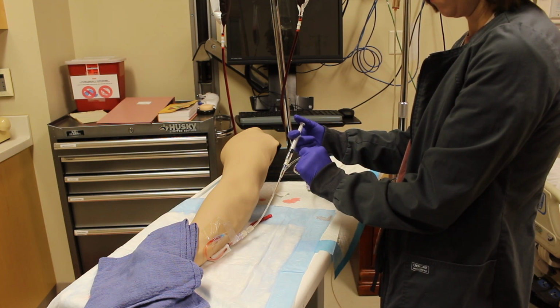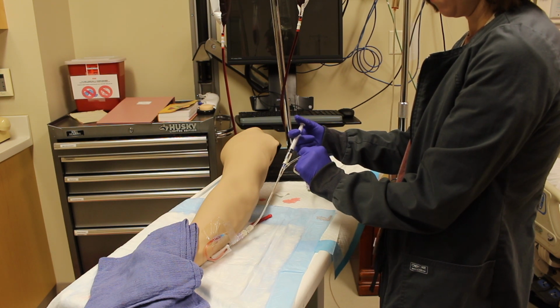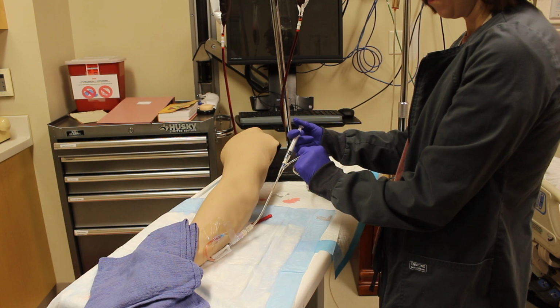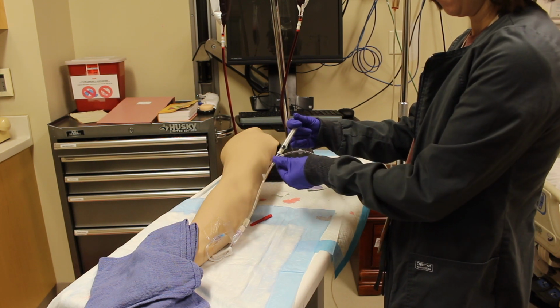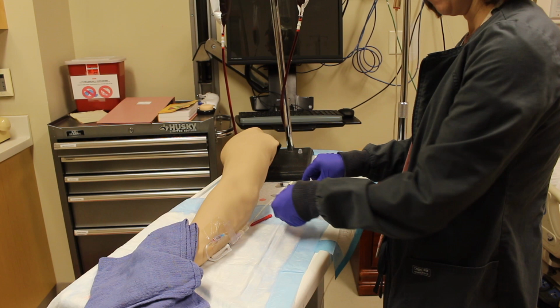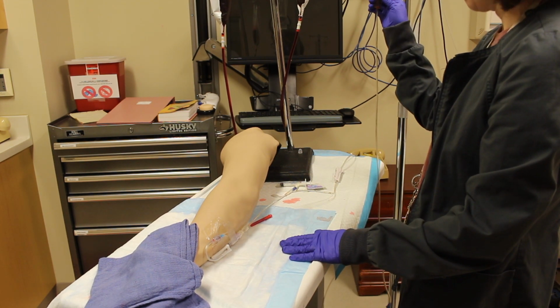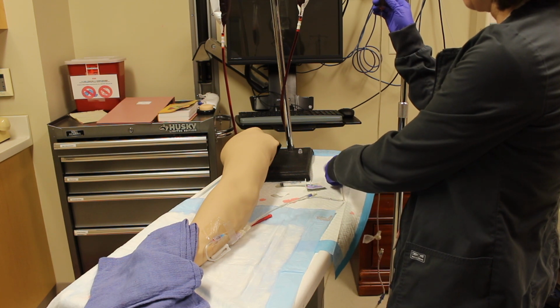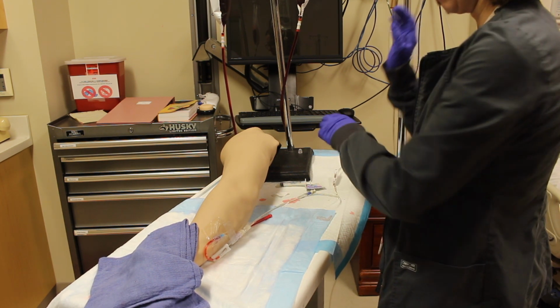Administer the medication slowly in small increments and according to the IV push rate while observing for reactions to the medication. Unclamp or release the IV tubing. Dispose of supplies safely. When you administer through a primary IV line, the medication will move through the IV line afterwards because of the infusion that is currently being infused.